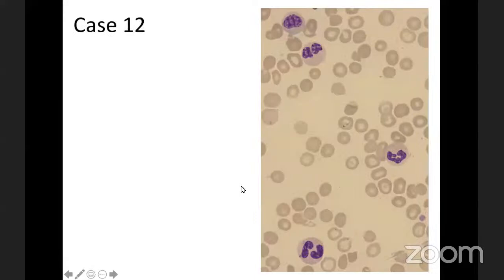And this is your finding. So in the previous case, we had a leukocytosis, which may disrupt your finding. But in this case, I think it's going to be very clear for you. So we have neutrophils that are bilobed, and we have a separated lobe in the neutrophil.